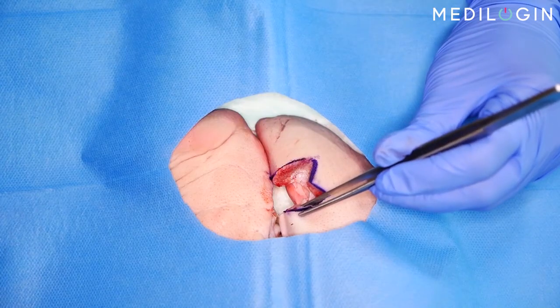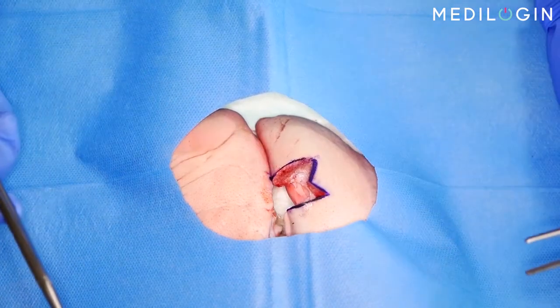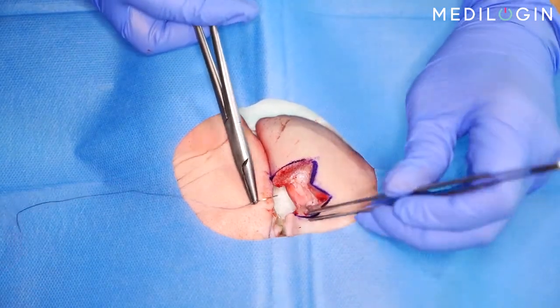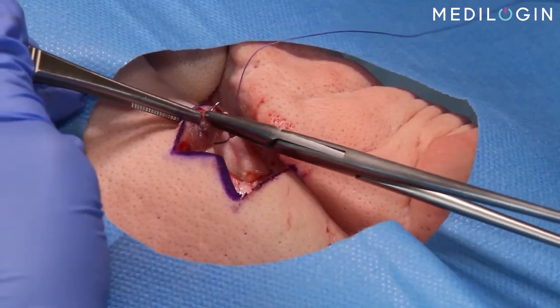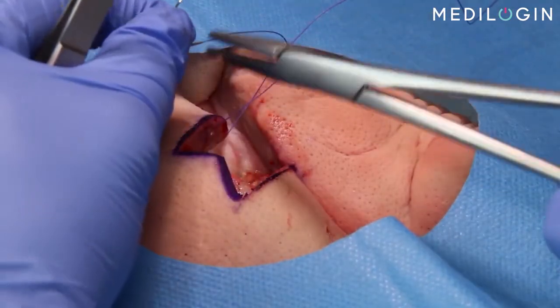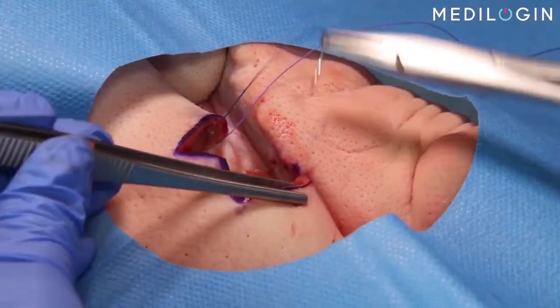The aim is to connect the two sides directly on the lip. For this reason, the first suture is made subcutaneously. Make sure that the two puncture points are exactly opposite each other. Remember that the first subcutaneous sutures should always be placed at the points exposed to the most tension.